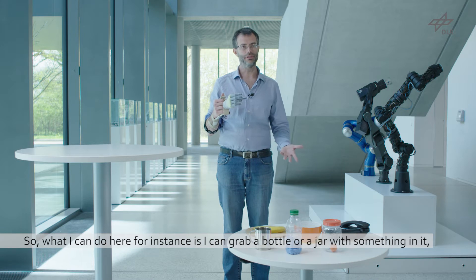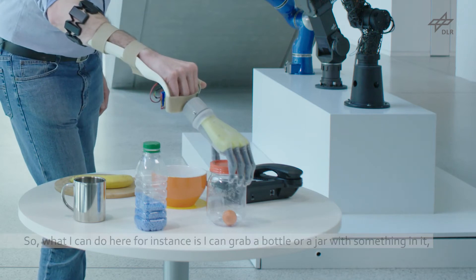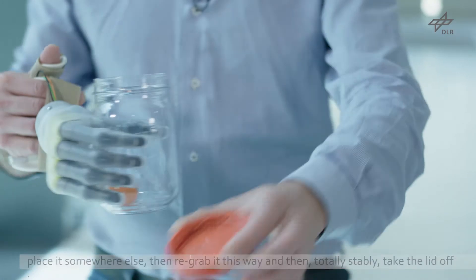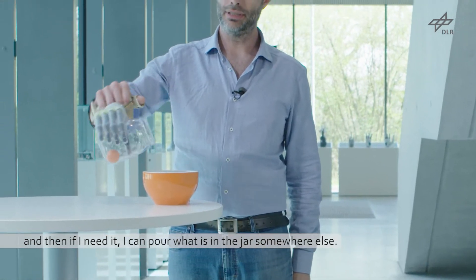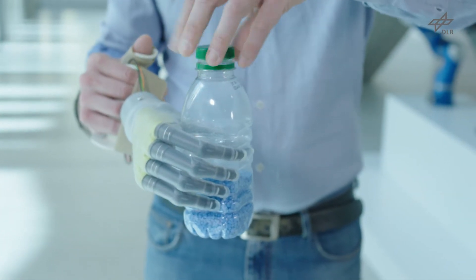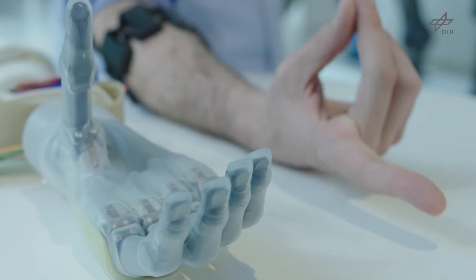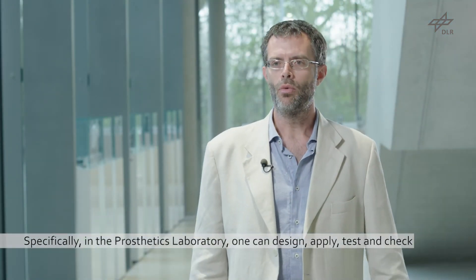For instance, I can grab a bottle or a jar with something in it, place it somewhere else, then re-grab it and totally stably take the lid off, and then if needed, pour what's in the jar somewhere else.